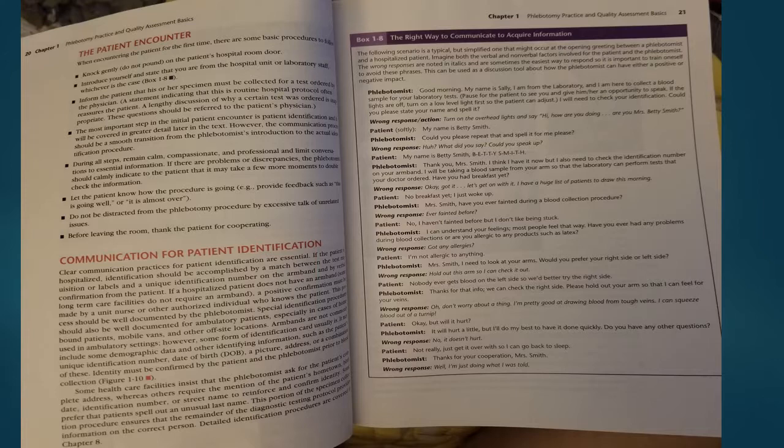Communication for patient identification. Clear communication practices for patient identification are essential. If the patient is hospitalized, identification should be accomplished by a match between the test requisition or labels and a unique identification number on the armband, and by verbal confirmation from the patient. If a hospitalized patient does not have an armband, as some long-term facilities do not require an armband, a positive confirmation must be made by a unit nurse or other authorized individual who knows the patient. This process should be well documented by the phlebotomist.